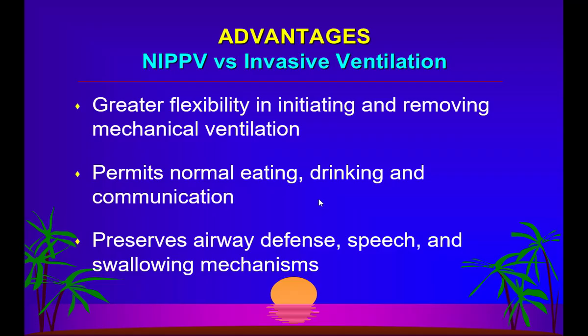So coming to the advantages, there is greater flexibility in initiating and removing the mechanical ventilation, because it is outside, it is over the face, and you can just remove the mask, even though the patient is continuing to be in respiratory distress. Not like invasive ventilation. Once the patient is hooked on the ventilator, it can be weaned off only when his respiratory distress or his ventilation has improved. It can permit normal eating, drinking, and communication.